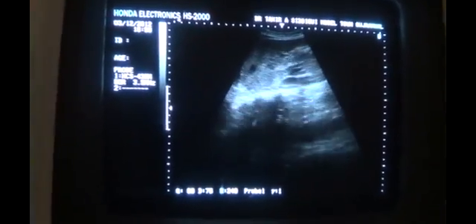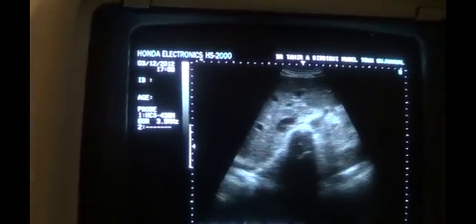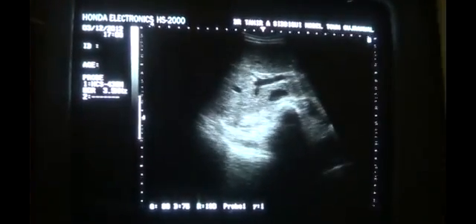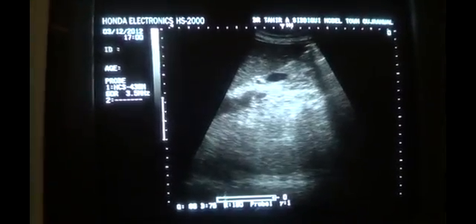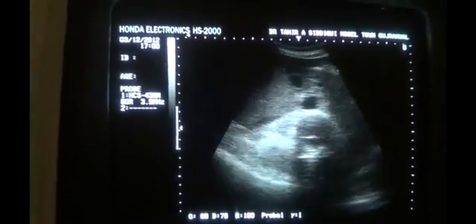How do we measure the liver by ultrasound? You may come across a condition in which, in this case, let me start from here, we are seeing the liver below the costal margin, no doubt about that. This is the liver which is being seen below the costal margin. Number 2, the angle of the liver is sharp. This angle is sharp, seen below the costal margin.